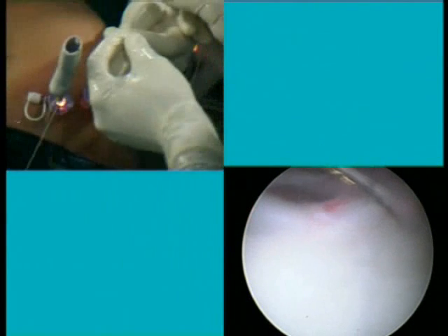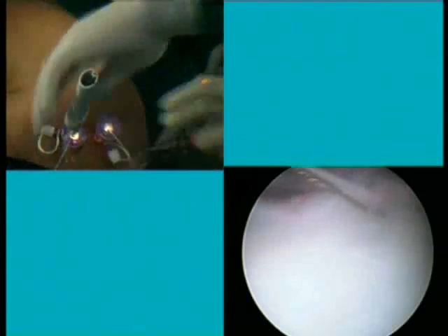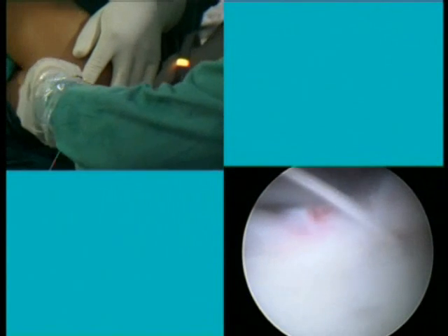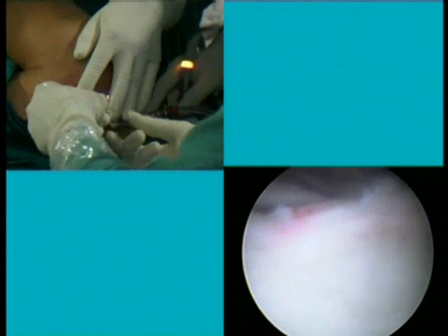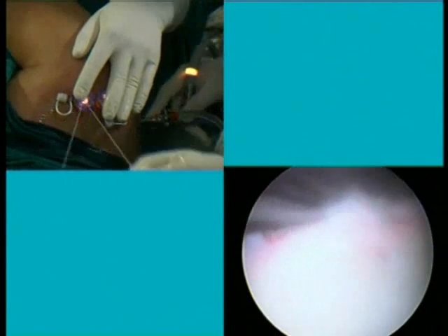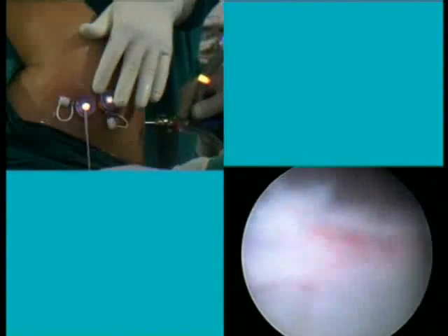Sanjay, we are only with you for another 5 minutes. Soon we see this knot. We may have to shift to another talk, I'm afraid. Okay, and I'll also be here for another 5-10 minutes because it doesn't need more than 2 anchors. Yes, that's right. It would be nice to see the mattress knot. Yes. And you always try to put that inferiorly, as you said, there's enough evidence now in the literature to confirm better fixation compared to a single simple knot.